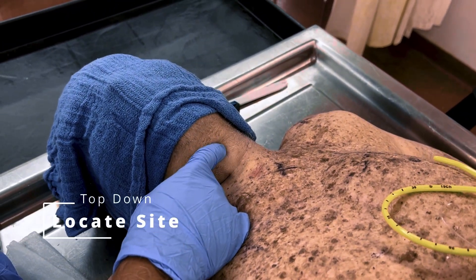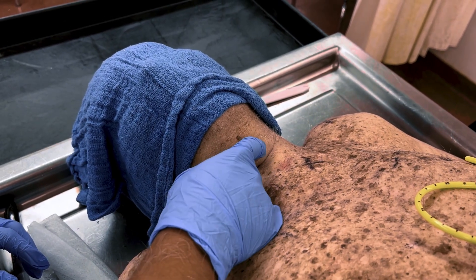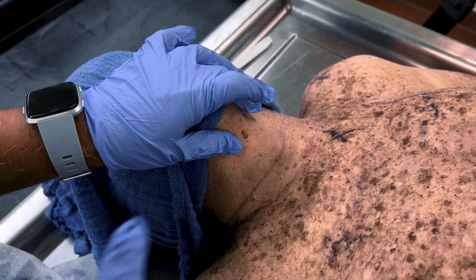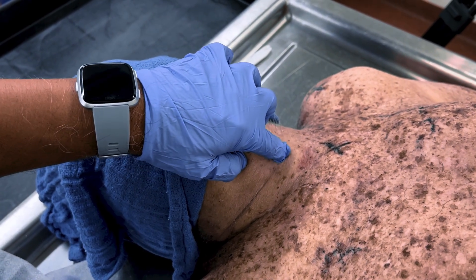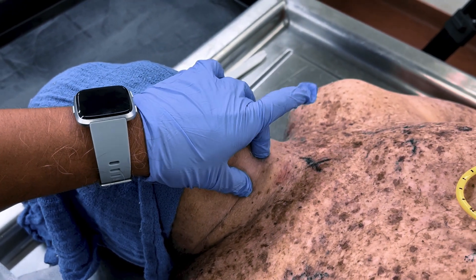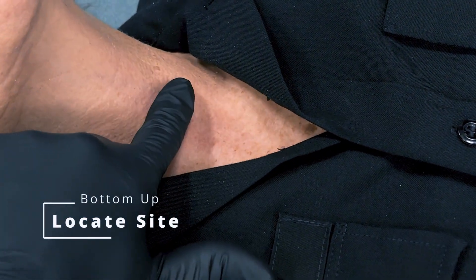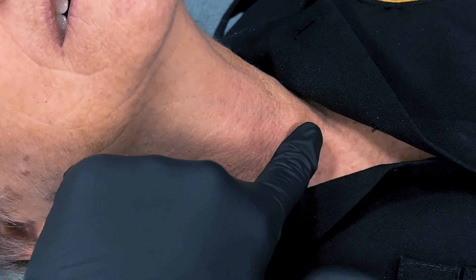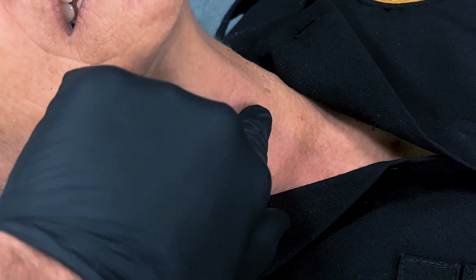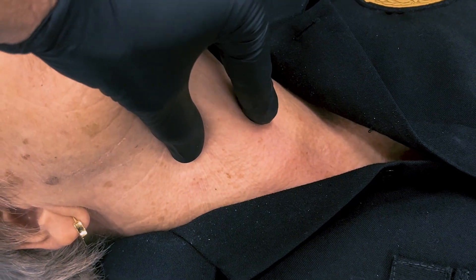To locate the cricothyroid membrane, place your non-dominant hand on the chin-neck junction. Slide your index finger down the trachea until you feel the thyroid cartilage, also known as the Adam's apple, and move it down to the soft depression between the thyroid cartilage and cricoid ring. Some patients may require an alternate approach: locate the sternal notch with your non-dominant hand, slide your index finger up the trachea until you feel the cricoid ring, and move it up to the soft depression between the thyroid cartilage and cricoid ring.